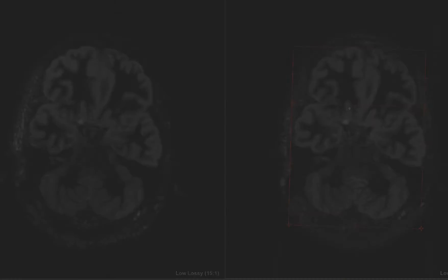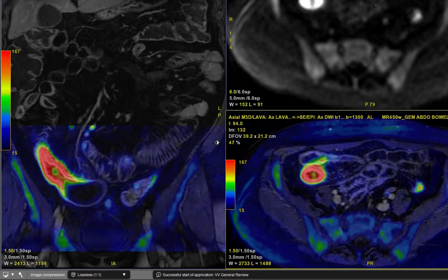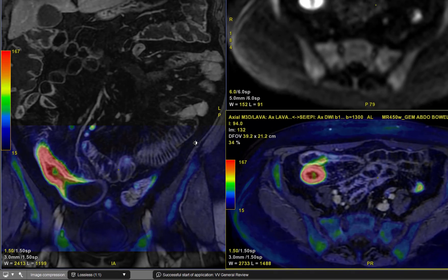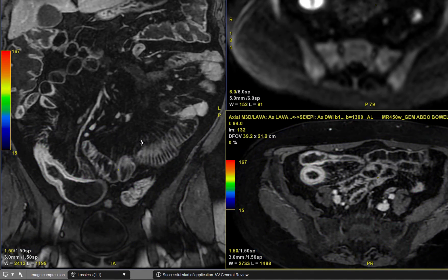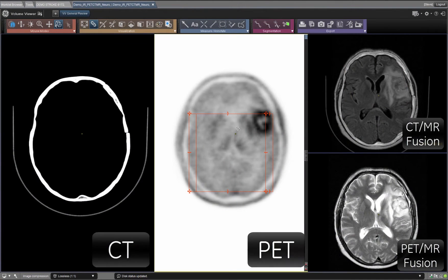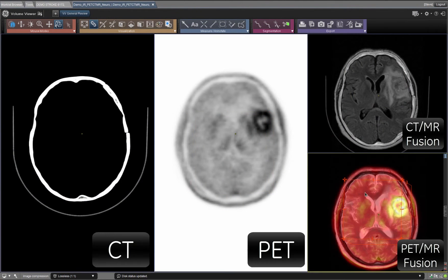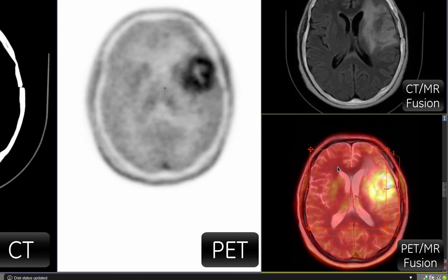Additionally, integrated registration also allows MR to MR fusion or even multi-modality fusion to aid in improving accuracy and focused analysis.